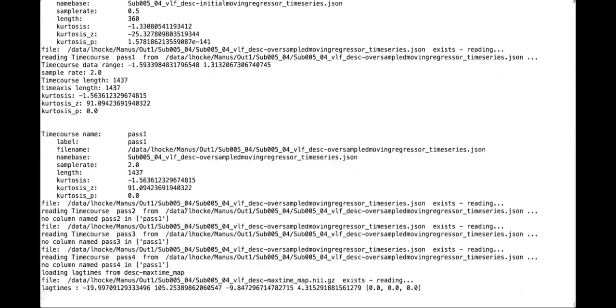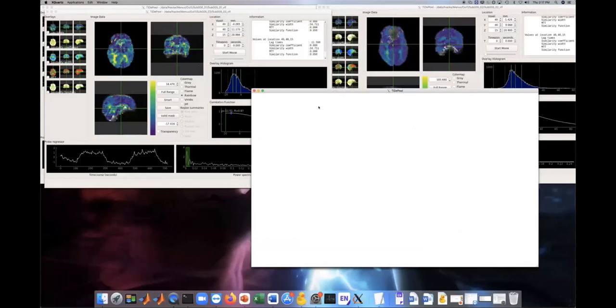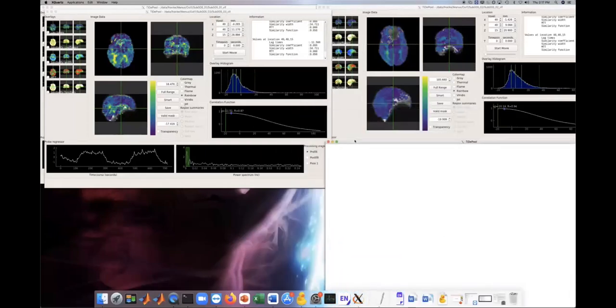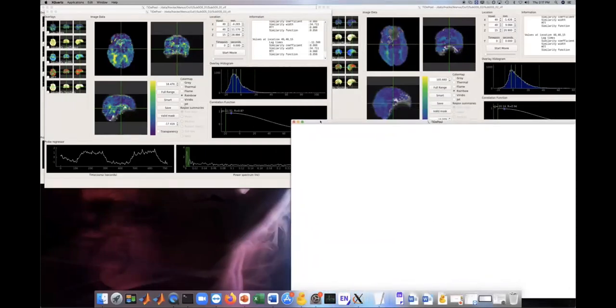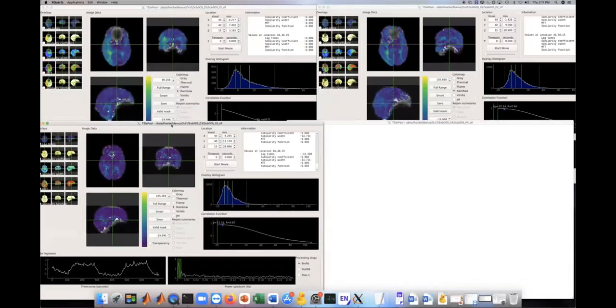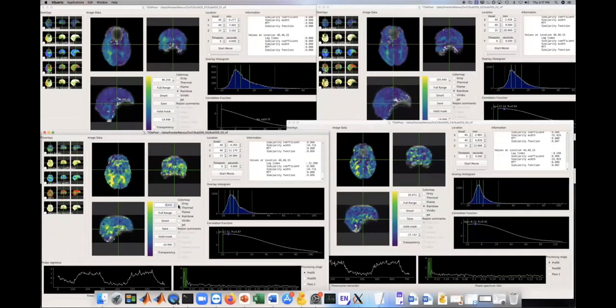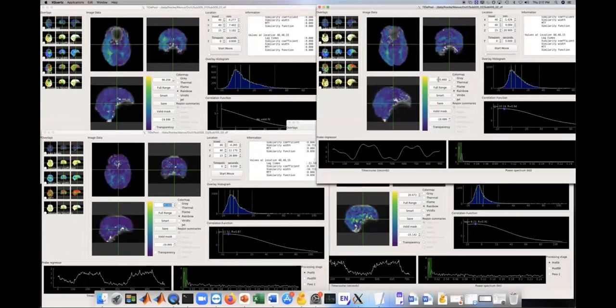But here you see already in the second tidepool window is a decrease from the area which you've seen before, which had these very long delays on the right side. With more months passing, you see again a reduction, and the fourth scan, when it comes, you see even less of the green yellowish areas when you adjust them all to the same search range.